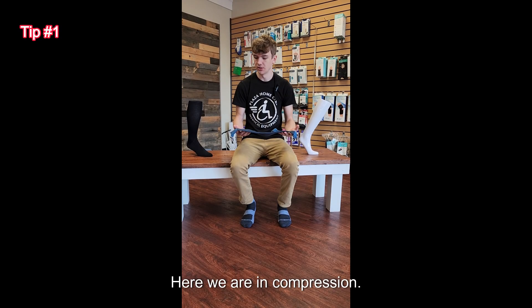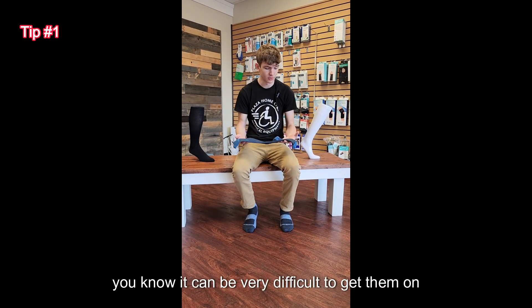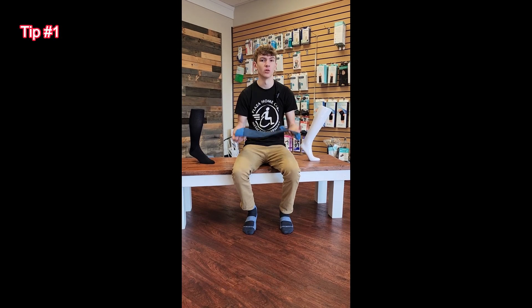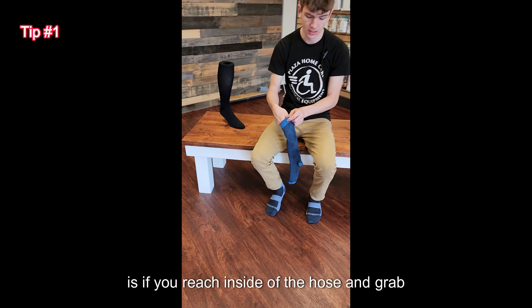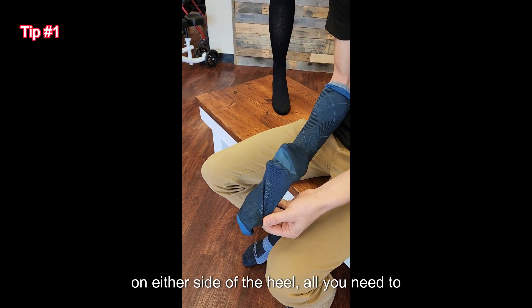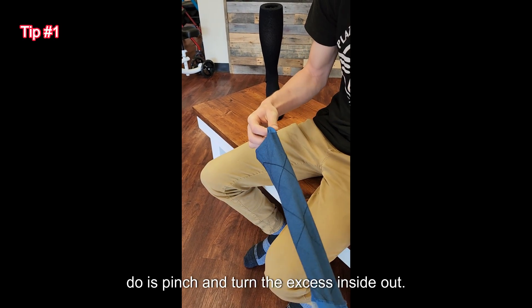Here we are in compression. If you've worn these before, you know it can be very difficult to get them on without any aids. A really good trick is to reach inside of the hose and grab on either side of the heel. All you need to do is pinch and turn the excess inside out.